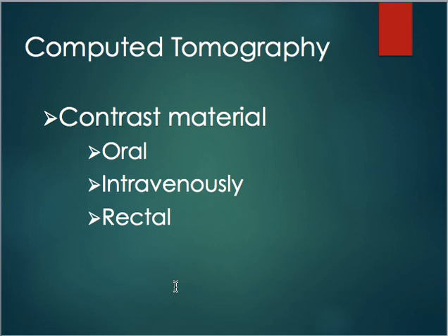Contrast can be used orally, so that means the patient's going to drink it. It can be given intravenously, which is an injection through the vein, or it can be administered rectally, which is contrast in the rectum, just like a BE study would do. So again, it's our job to watch for reactions to the patient and also to inform them of what common, normal reactions are. So remember, just like I talked about in fluoroscopy, anytime we give contrast through the IV or intravenously, the patient can have a warm flushed feeling, they can have a metallic taste in their mouth, and they can feel like they wet their pants.